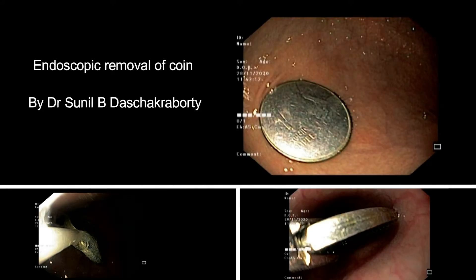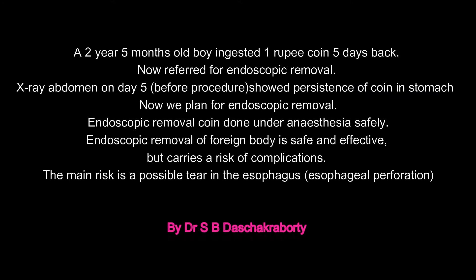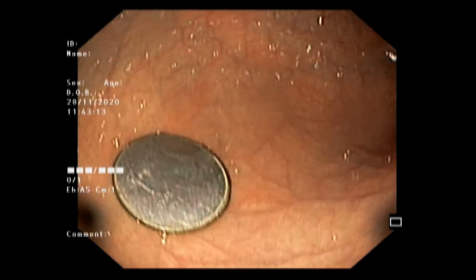Today I will present an interesting video of endoscopic removal of a coin. A two-and-a-half-year-old boy ingested a coin five days earlier and was referred to us for endoscopic removal. We planned for endoscopic removal of the coin under anesthesia.